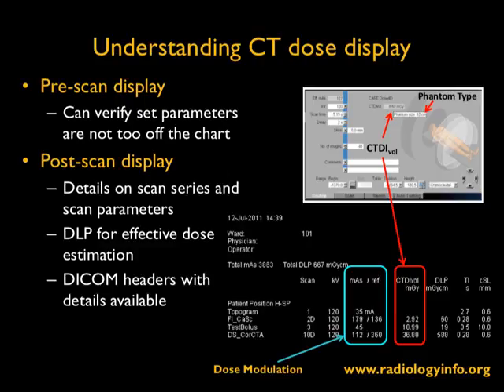On the post-scan display shown here in the bottom right-hand corner for one particular manufacturer, it provides details on scan series and scan parameters, and also shows the DLP, which can be used by a medical physicist or radiologist to arrive at an effective dose estimation. Going one step further, all images now have a DICOM standard structured dose report in the DICOM header, containing even more CT dose information. From the post-scan display, one can determine the scan type, technique used, dose delivered, and derive an effective dose value.